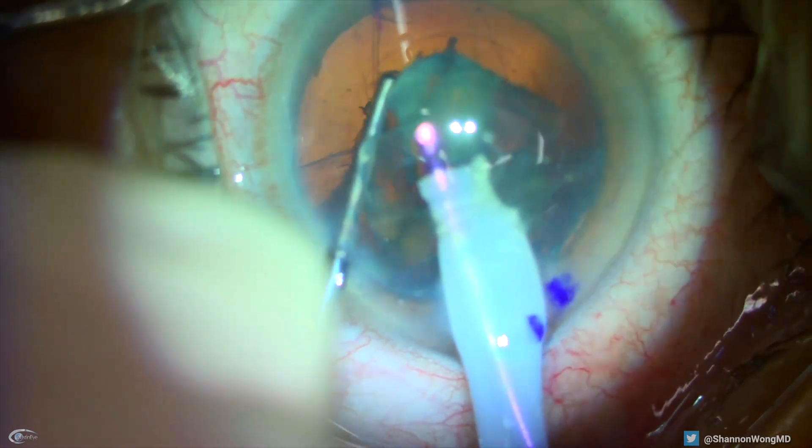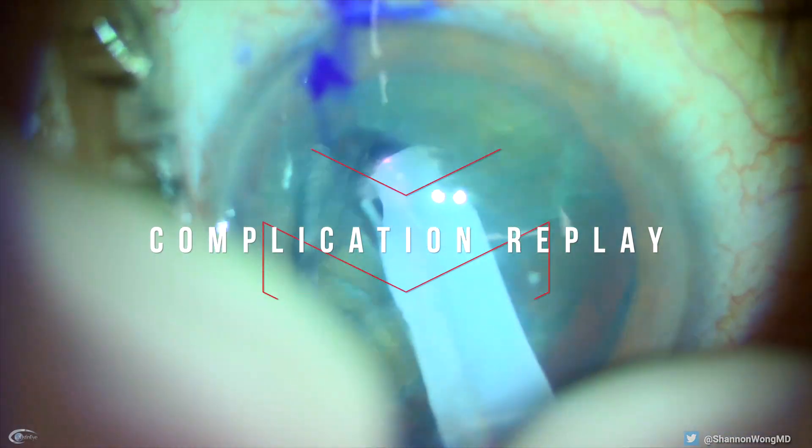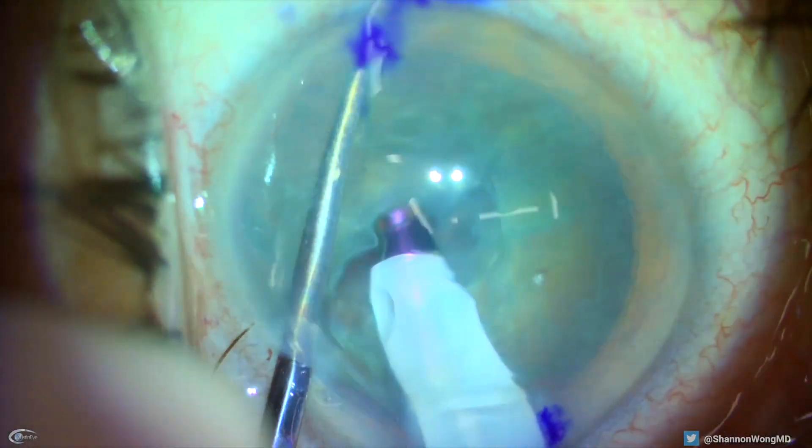Let's rewind and let me show you how we created our own complication. Here's our first horizontal chop to bisect one hemi-nucleus.